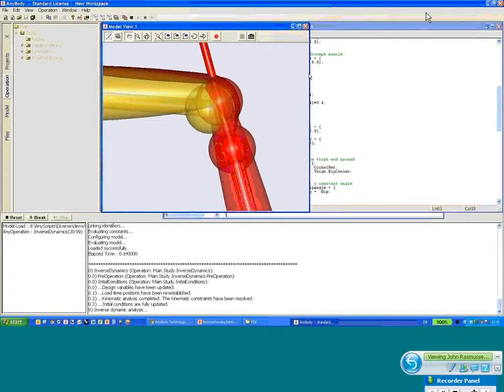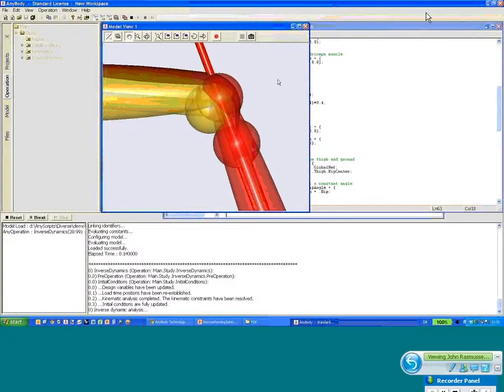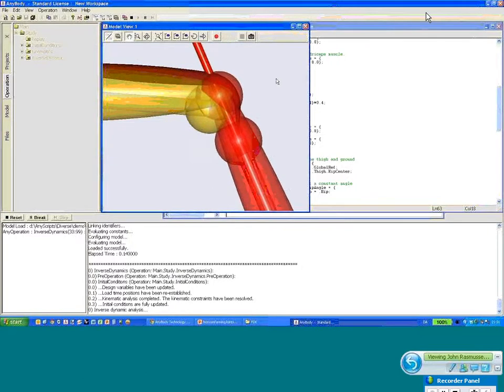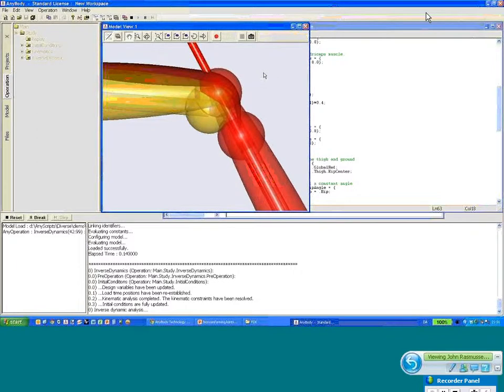Now imagine that you are building a knee prosthesis that had a certain geometry and certain stabilizing elements. And this was not a very simple model, but actually an anatomically realistic model of the lower extremity like we have in our model repository. And we subjected this to various activities of daily living rather than a simple extension like this one. Then we could actually study how the knee prosthesis would work under those conditions. And that is, of course, one of the purposes of building this technology that you see here.